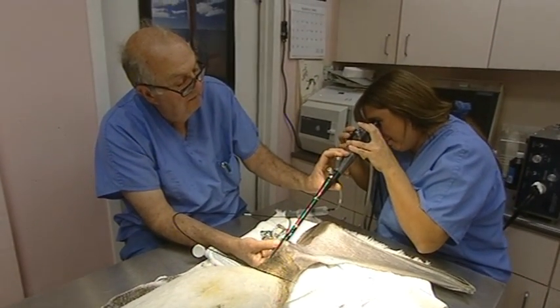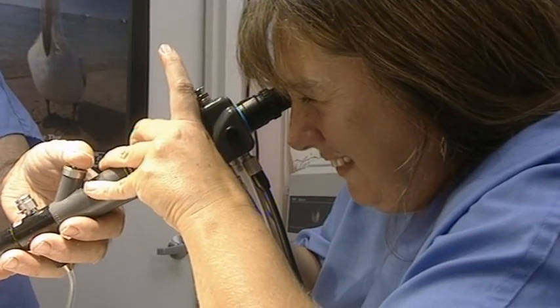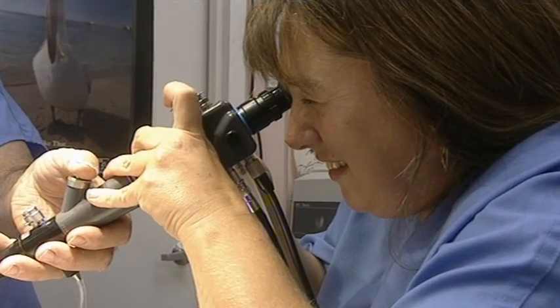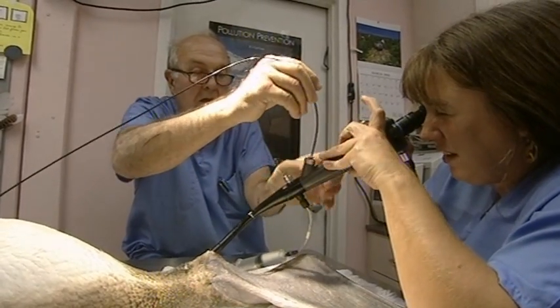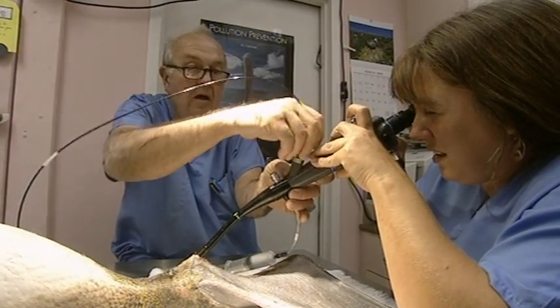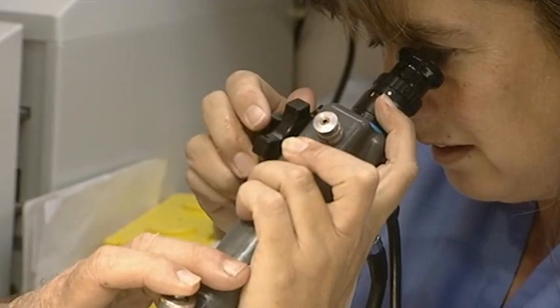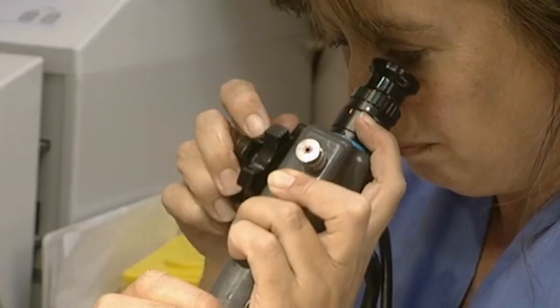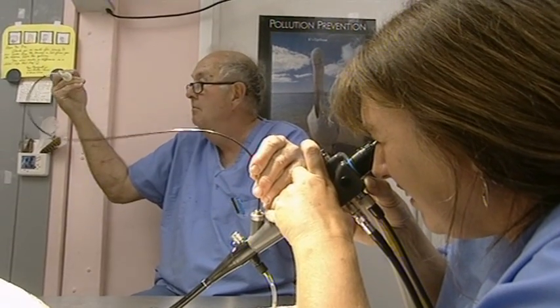Harry and Wendy are trying to get a sighting of it with an endoscope. There is the hook. The grabber. Rather than call in Buddy to do an operation, they're trying to remove the hook themselves with the endoscope and a grab wire. It's a difficult procedure — the equipment is designed for humans, not pelicans.